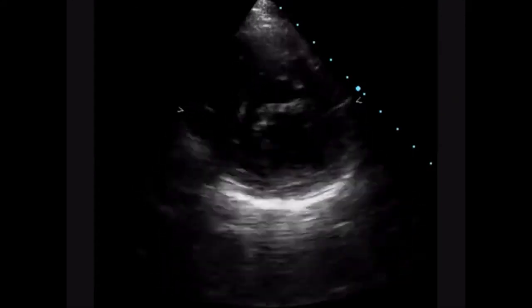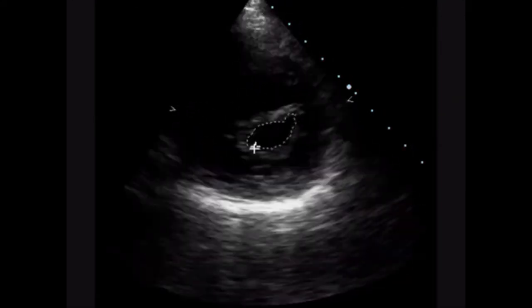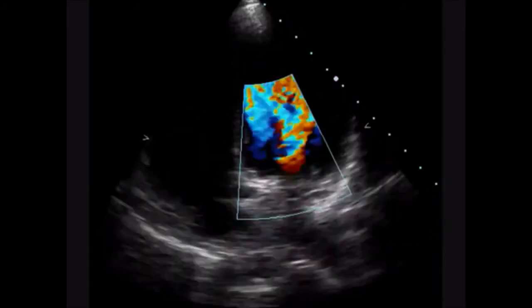This is the short axis view where the mitral orifice can be seen. You can see that there is a good orifice after balloon valvulotomy.